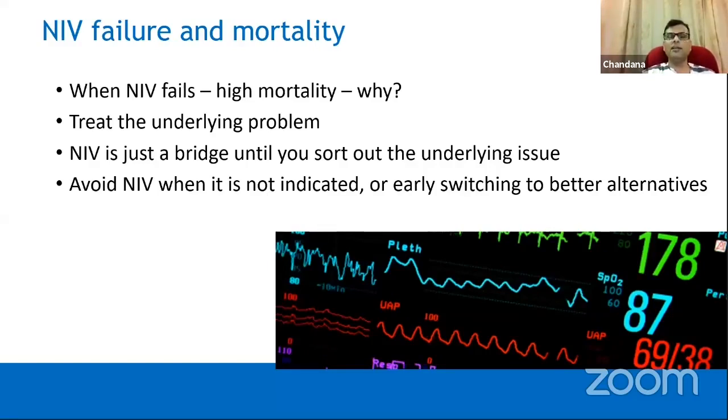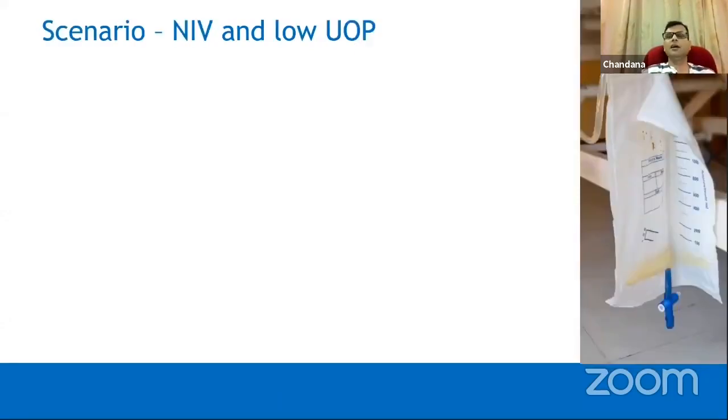But if you have 15 liters, try to increase it to more than 15. The marking goes up to 15, but if you increase it a little bit more, you get slightly more than 15 liters. It's not a very high value, but even that amount will ideally benefit the patient.